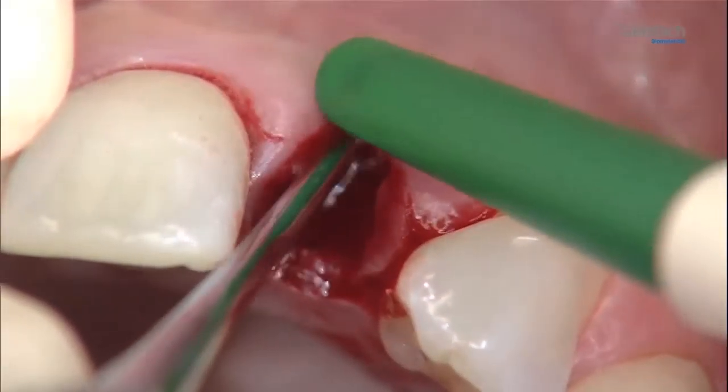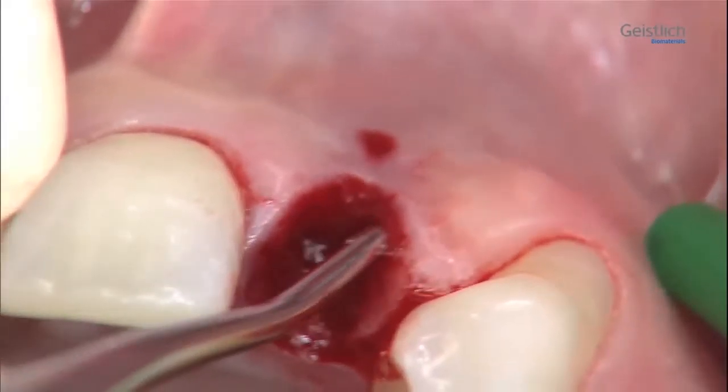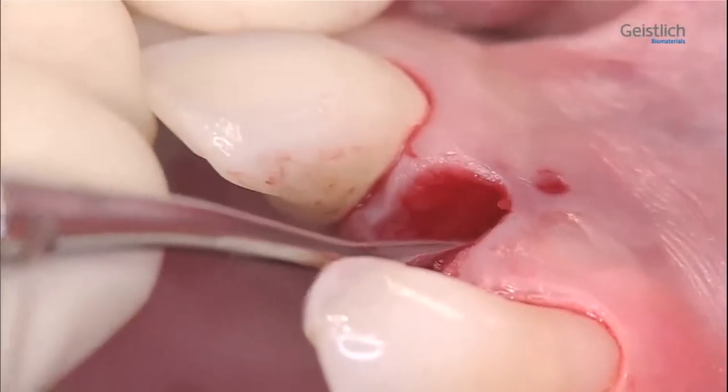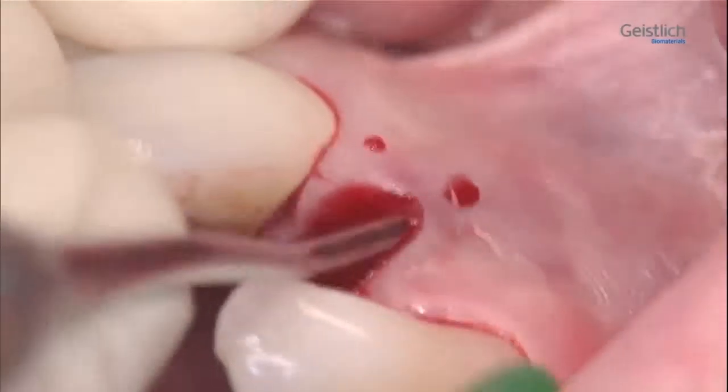We detach the buccal mucosa at site 2-2 and at part of the adjacent sites 2-1 and 2-3 from the bone with a tunneling instrument. This creates space for the membrane.